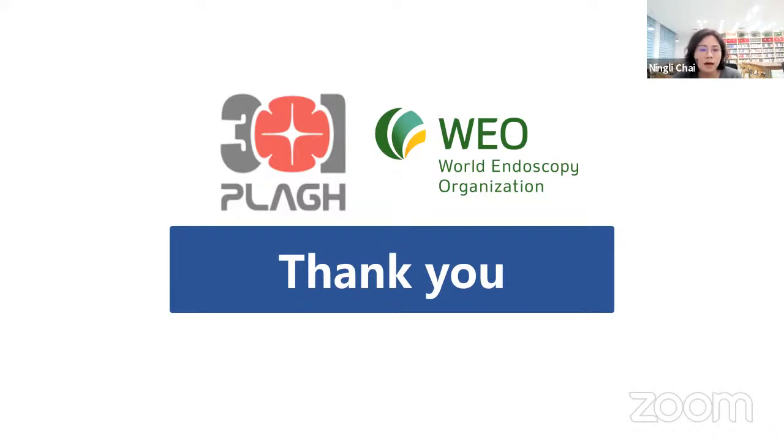Professor Linghu, my question is: the means is different from endoscopic medical surgery and traditional surgery. Do you think SIMS will take the place of MIS in the future?